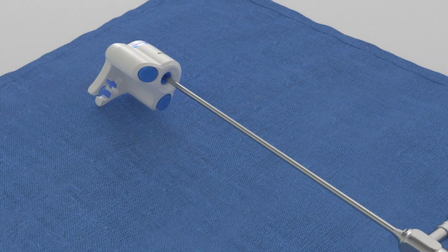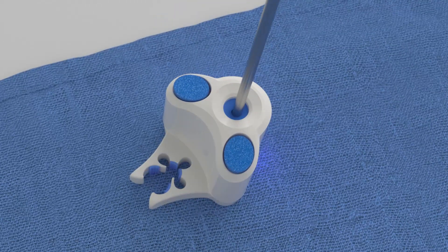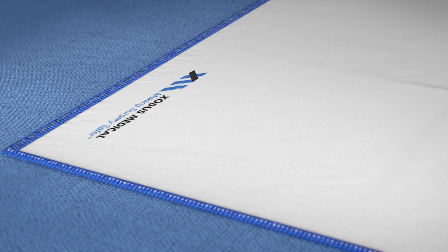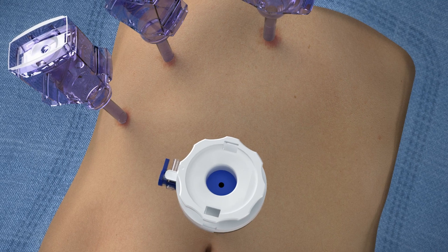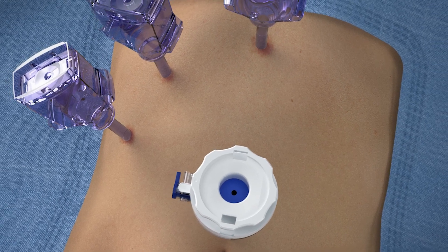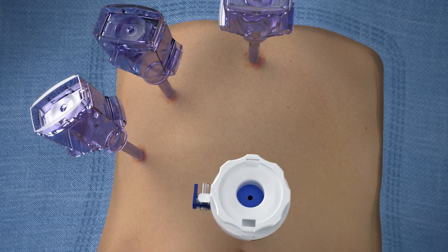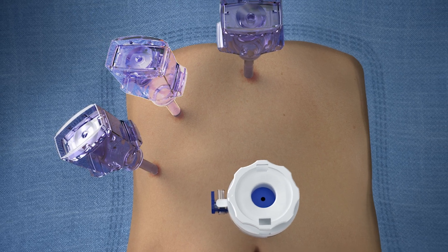Upon completing the warming stage, remove the laparoscope from the C-Sharp and tap away any residual solution on the included microfiber cloth. While the C-Sharp may be used on the back table, it is intended for use on a trocar, either the camera's trocar or another within the sterile field, per surgeon preference.